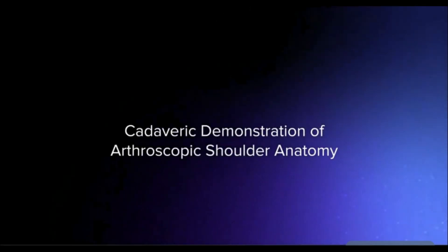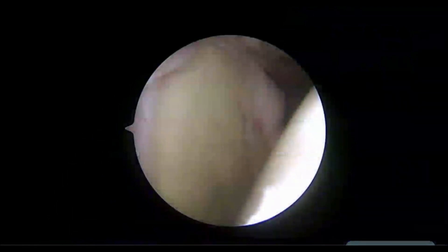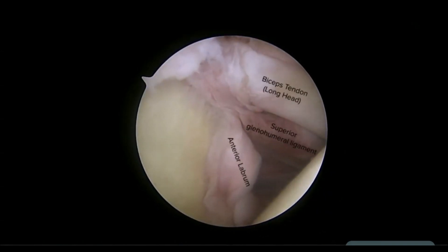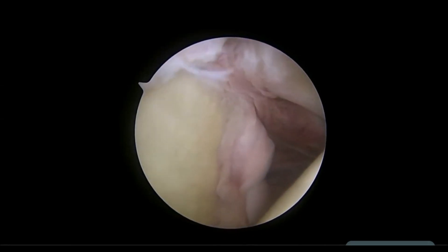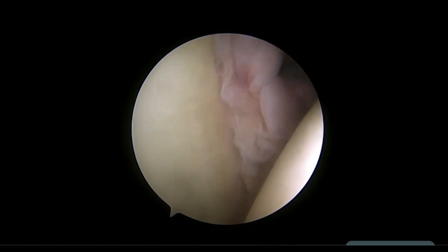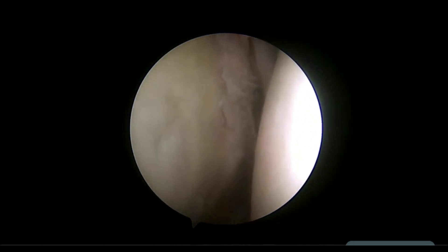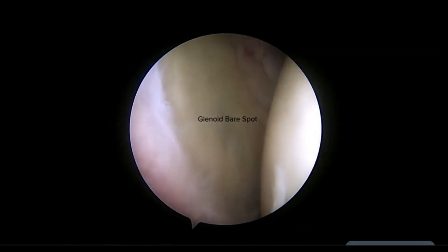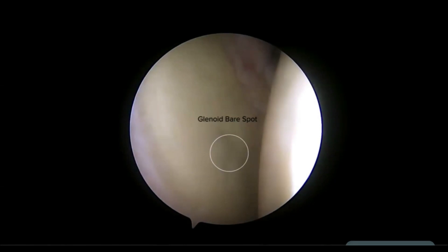In this cadaveric video, we have the right shoulder of a patient in an upright beach chair position. Viewing from the posterior portal, the glenoid is on the left and the humeral head on the right. Advancing the camera anteriorly, the long head of the biceps comes into view, as well as the anterior labrum and superior glenohumeral ligament medially. As the camera is driven inferiorly, the entire inferior labrum comes into view as the humeral head is distracted away from the glenoid. The posterior labrum and glenoid bare spot are also visualized.